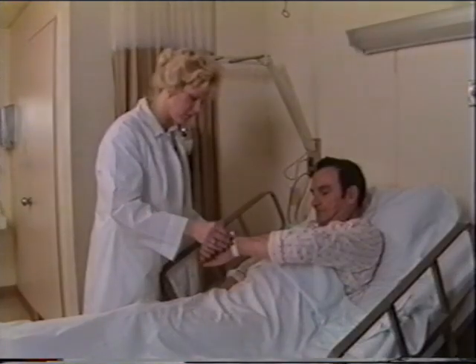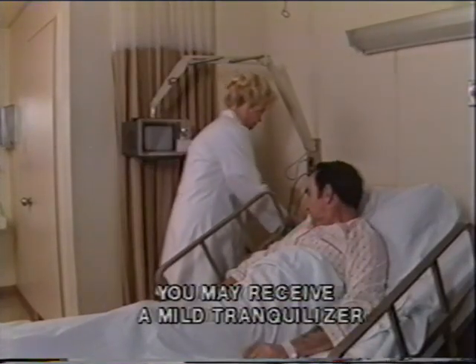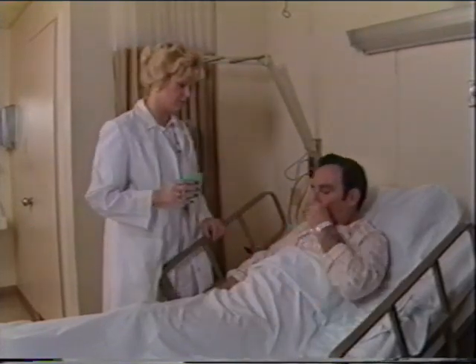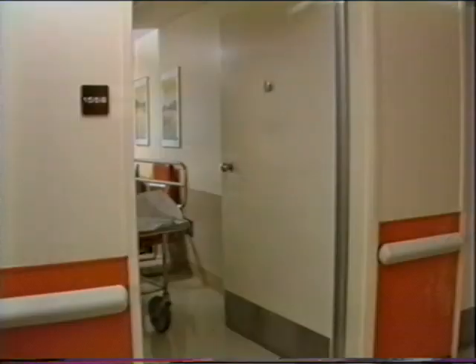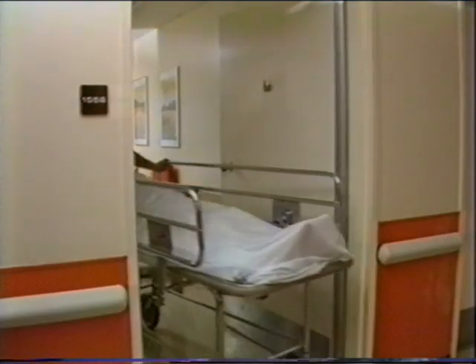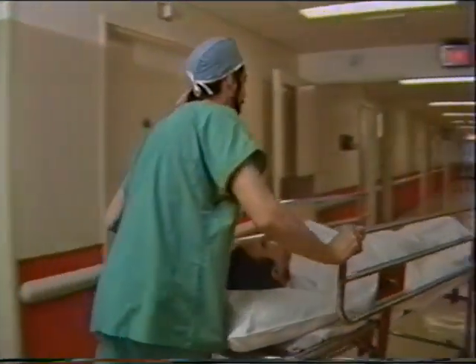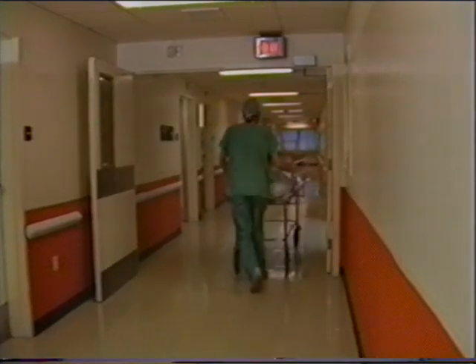About half an hour before the cardiac catheterization, your nurse may give you a mild tranquilizer for relaxation. It might also make you feel sleepy. You will be encouraged to urinate before leaving your room. You will then be taken to the cardiac catheterization lab, where your cardiologist and nurses will be waiting for you. This lab contains all the medical safety features of an operating room.